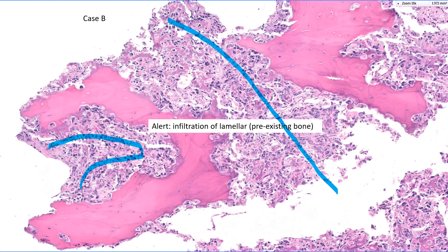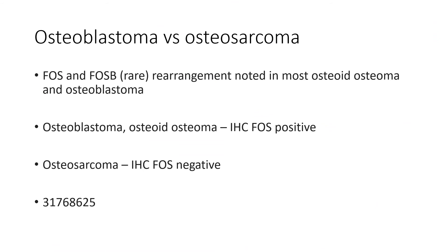Infiltration of pre-existing bone is a defining feature of osteosarcoma, and this is a lovely example of an osteoblastoma-like osteosarcoma. Can you use ancillary testing to make this distinction? Most osteoblastomas and osteoid osteomas have a rearrangement of the gene FOS, more rarely FOS-B. You can exploit that with immunohistochemistry: most osteoblastomas show immunohistochemical reactivity for FOS or FOS-B, while osteosarcomas are typically negative for FOS. We do use this antibody in challenging cases.